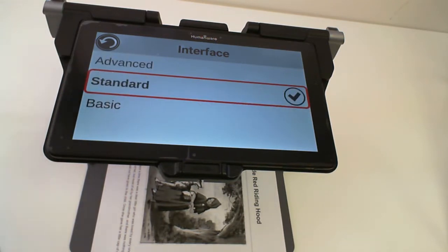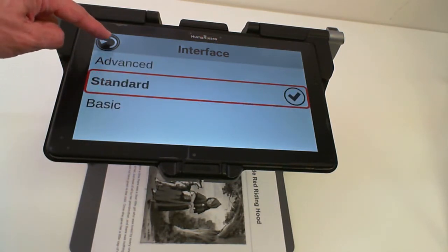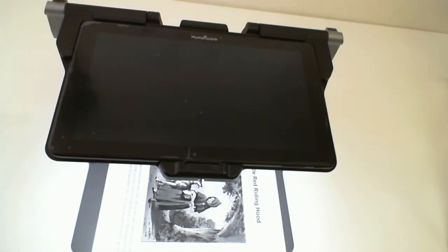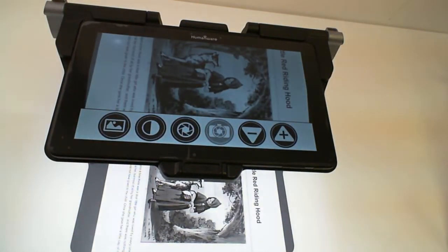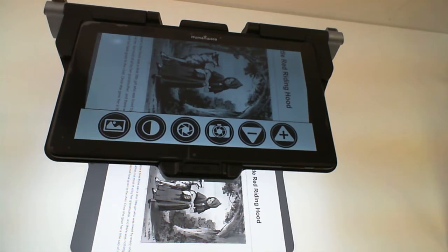Let's start with the Standard interface. By selecting Standard interface and going back, you will be brought to the Magnification application. This application will be your default application, so each time you boot your MATT Connect, you will end up in the Magnification application.